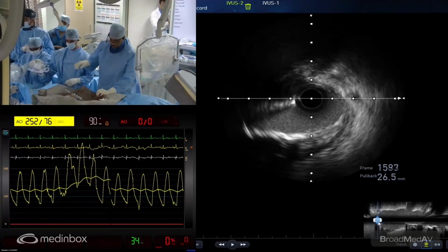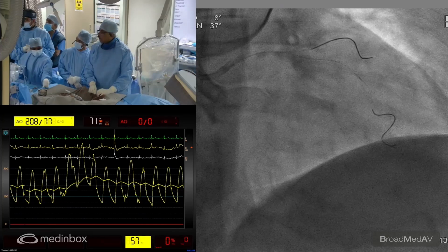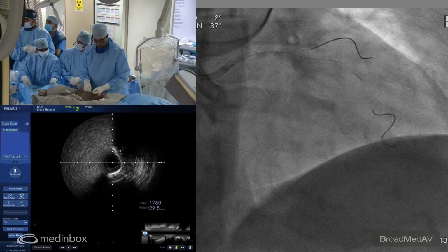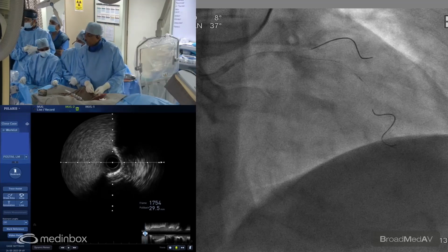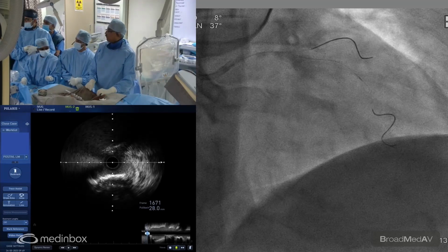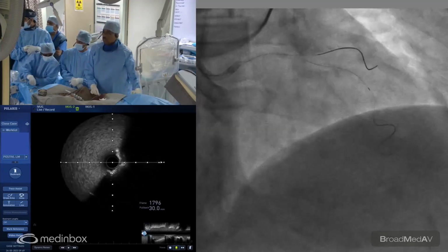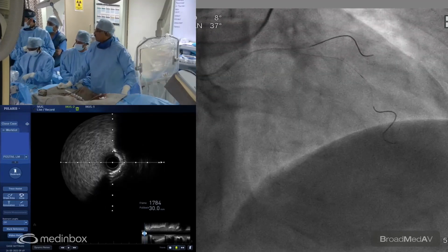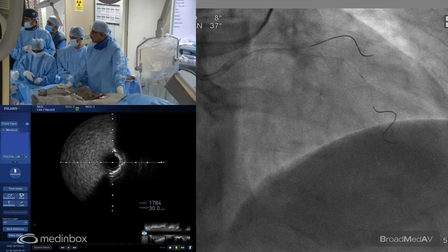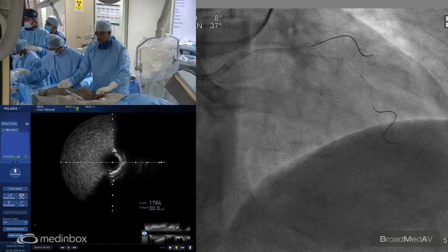So Nanda, can you just show the pictures again for ourselves and for the viewers? So this is the aorto-ostial 180-degree calcium, the arc, and the left side of the screen is the aorta, and the right side is the left main wall. As we move in, the calcium is only limited from 4 o'clock to 7 o'clock position. And here maybe we can say some micro dissections, some tracks are seen here. Apart from that, with IVL we don't expect anything else.